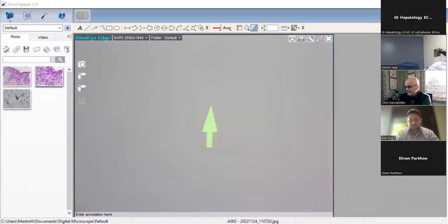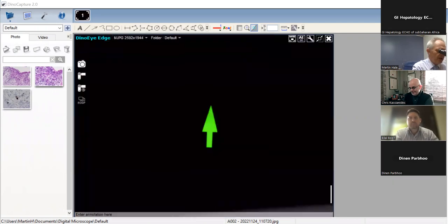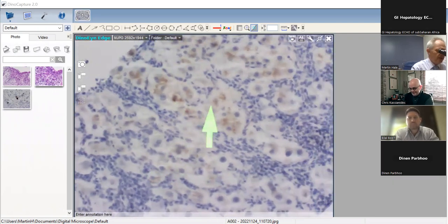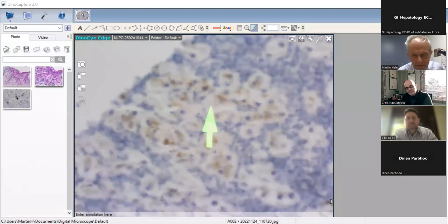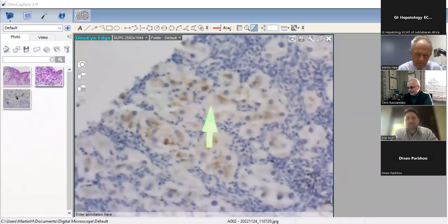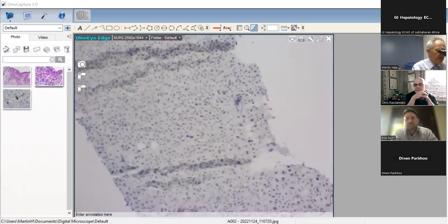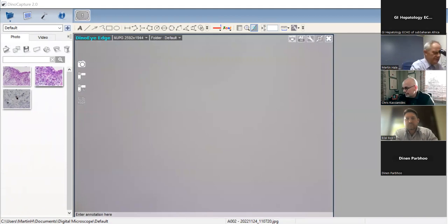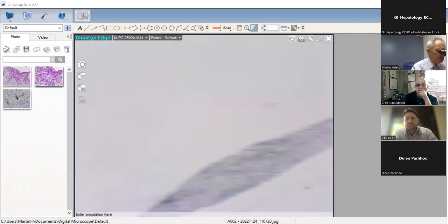And then the glypican 3 is also positive. But I say positive in inverted commas because it looks peculiar. It doesn't look like a normal glypican 3 positivity. We've got this rather dirty, patchy looking staining with glypican 3. Having said that though, I've seen HCCs where one sees that degree of fuzziness of the glypican 3 positivity staining. So as I said, to me, this is just making the problem a different color. The possibility does exist that this may represent a focal nodular hyperplasia, but in my heart of hearts, I can't call this HCC.